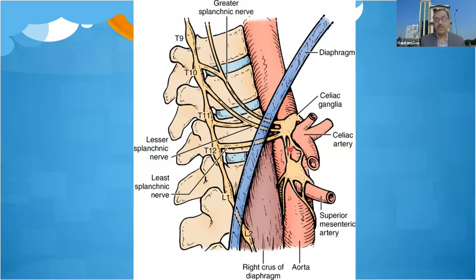It's like that. So celiac ganglion or celiac plexus, the better term is celiac plexus, because ganglion is only for the efferent fibers. But when you are doing the block, our target is the afferent fibers. Though we cannot block the afferent fibers separately, collateral damage will be there. Efferent fibers also will be blocked. But our target is afferent fibers. That is the reason why celiac plexus block is a better term. And celiac plexus block can be done on either side, or it can be done on only one side, because we are giving a larger volume that will be spreading.